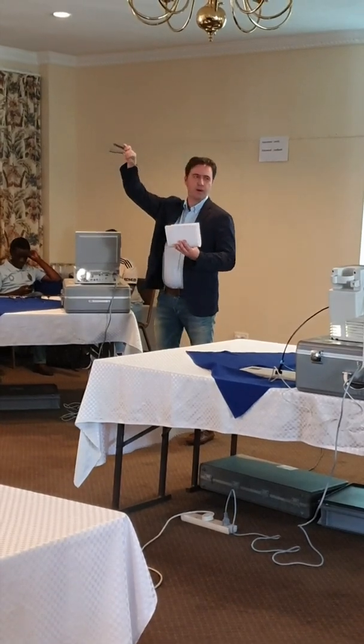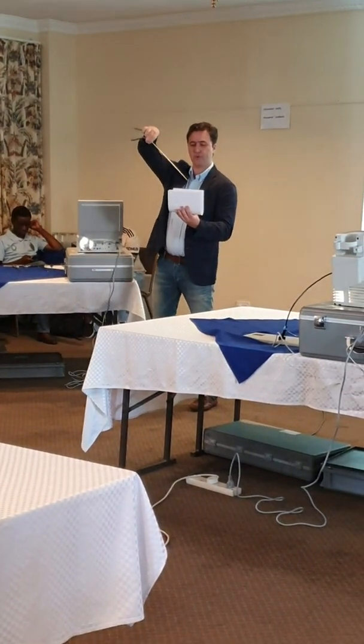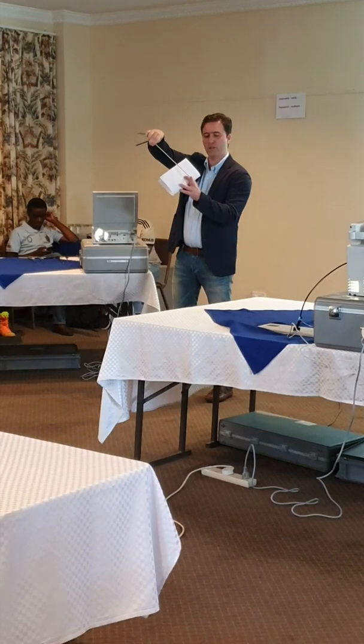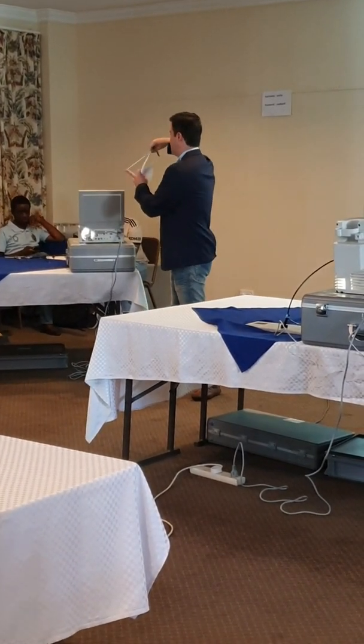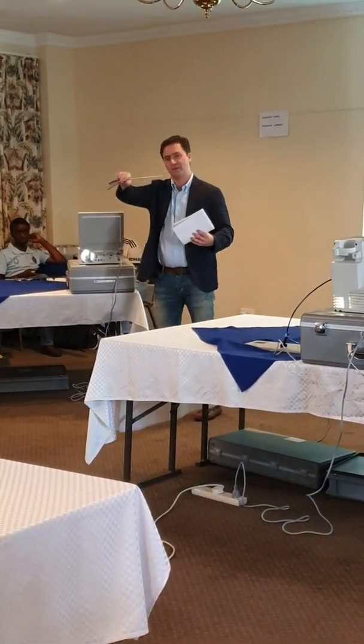You come from above, so you have to correct this, because if you come from above and your needle is placed just under 90 degrees in your needle holder, you're always doing suturing kind of backwards.